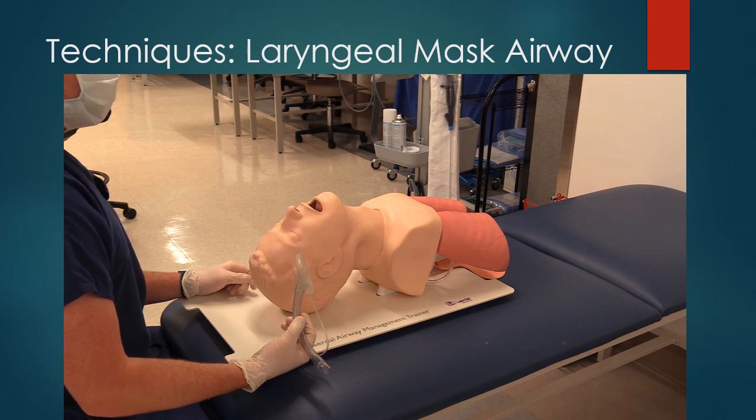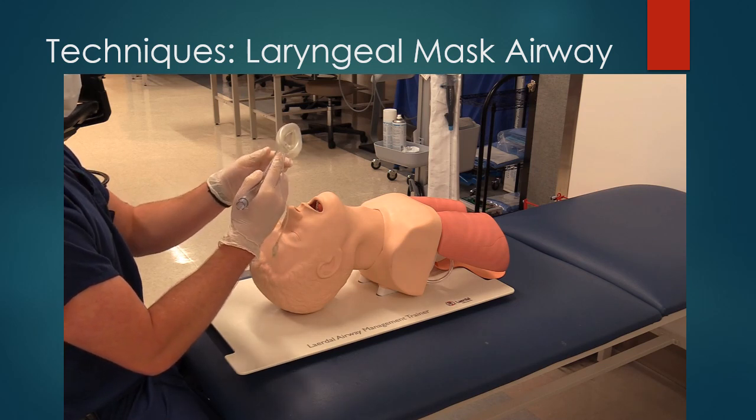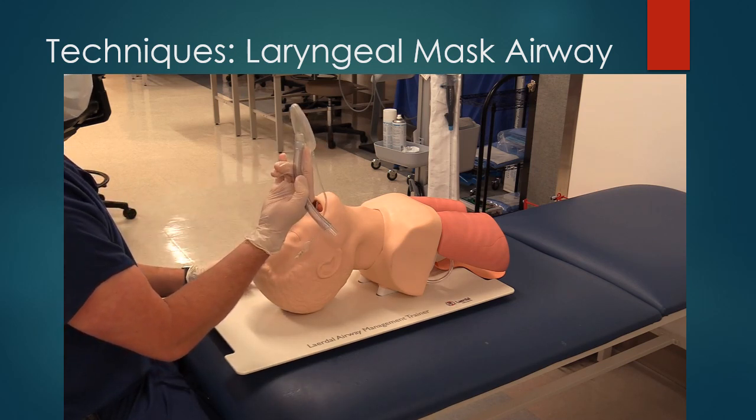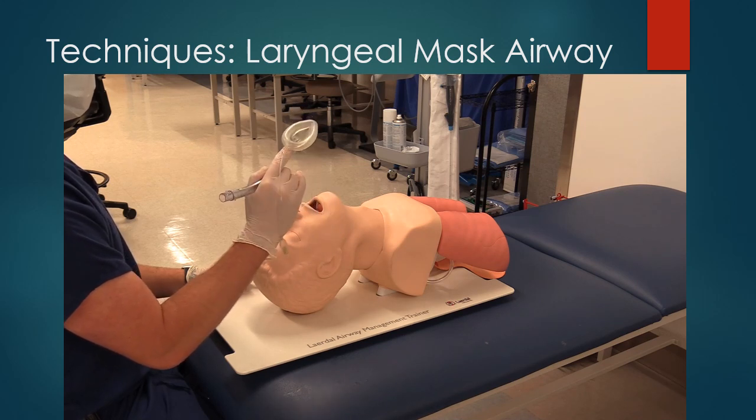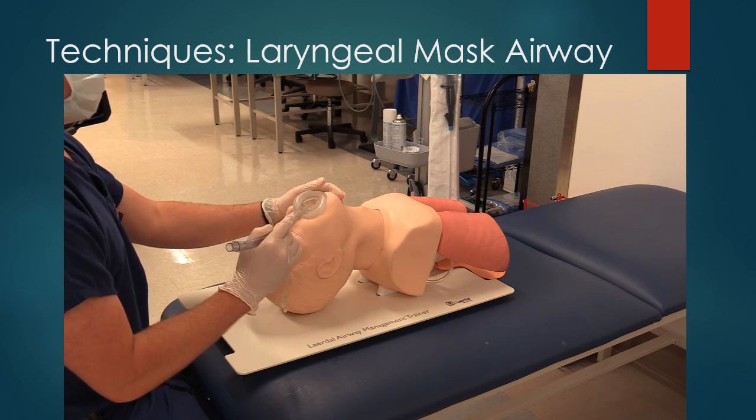Proper technique for this is to hold it in your dominant hand with the index finger sliding into the notch between the stalk and the mask. The manufacturer recommends fully deflating the cuff, although I find that this does not always work as well as leaving some air in the cuff. So know that that is against manufacturer recommendation, but I find it to be both safe and more effective in clinical practice.